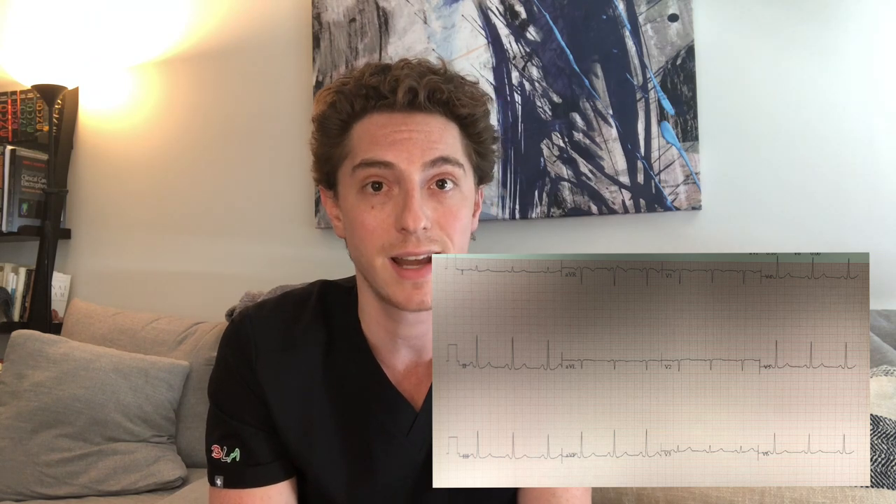Think about something else that can cause a left bundle pattern — a ventricular paced rhythm. So in patients with a left bundle or a V-paced rhythm, you don't want to perform just an EKG stress test; you want to add another imaging modality. Since ST depressions are how we diagnose ischemia, anyone who has baseline ST depressions makes an EKG stress test extremely difficult and uninterpretable — so you want to add on another imaging modality.